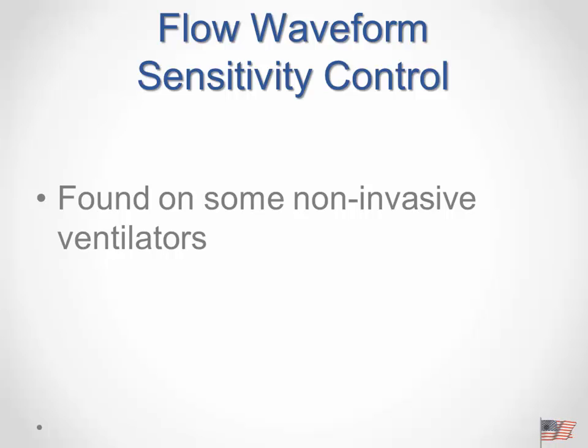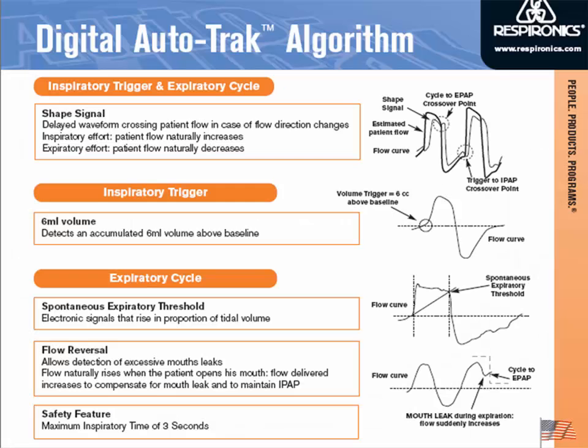Some non-invasive ventilators have a waveform sensitivity. If you remember back when we were talking about the Vision and the V60, they actually use a flow tracing as a triggering mechanism.